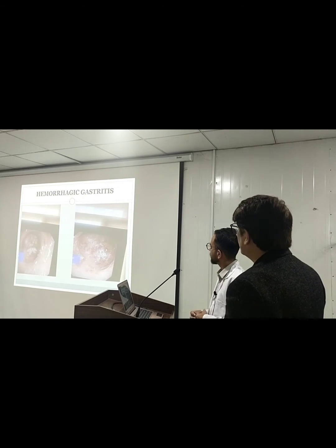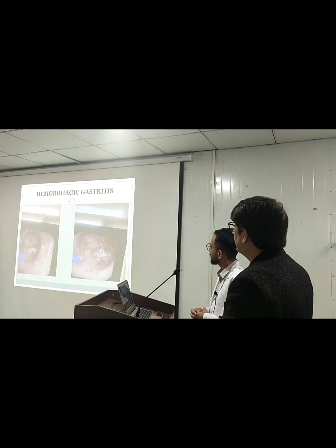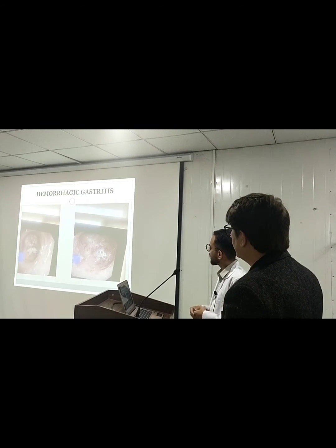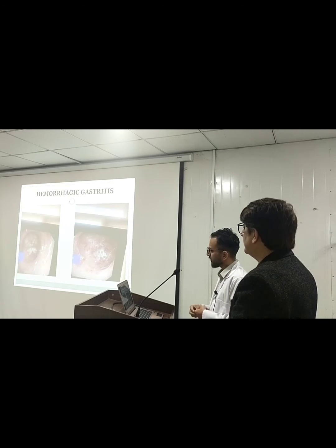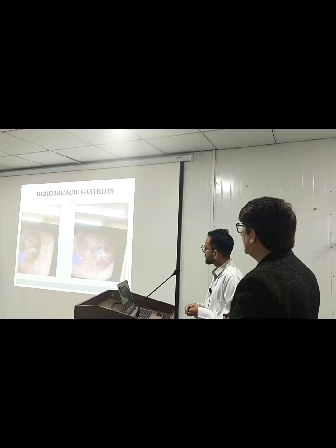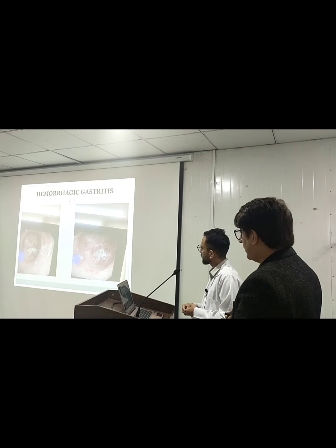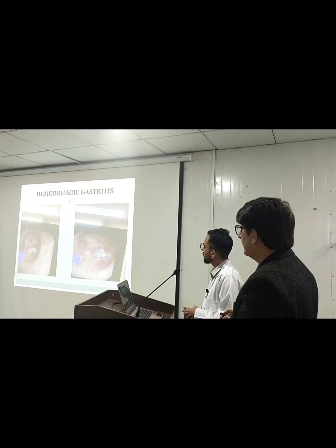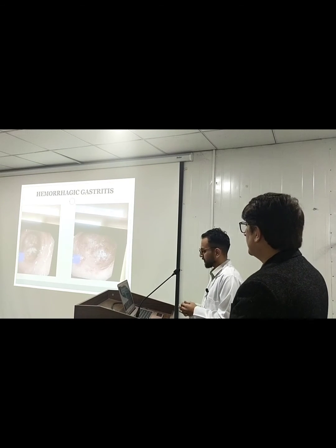Hemorrhagic gastritis. So this patient had a long history of frequent NSAID use. He presented with severe epigastric pain and a history of melena off and on. His endoscopy showed the pre-pyloric area and whole antrum were hemorrhagic with erythematous mucosa. So we took biopsies as well. Later on the biopsies turned out to be H. pylori induced gastritis, but that was hemorrhagic gastritis with pre-pyloric severe erythema. You can appreciate it.